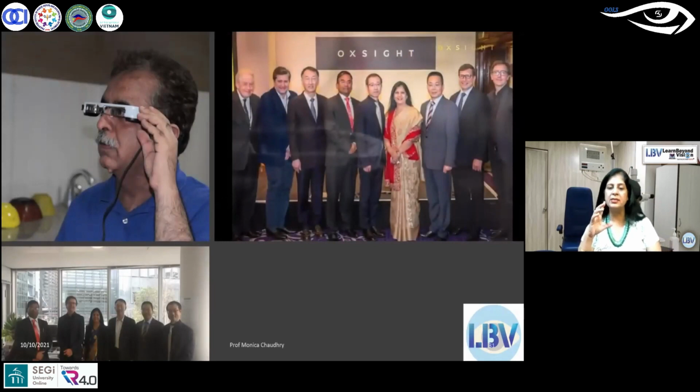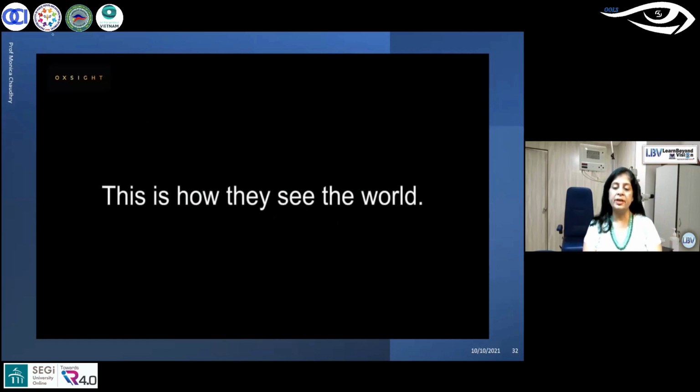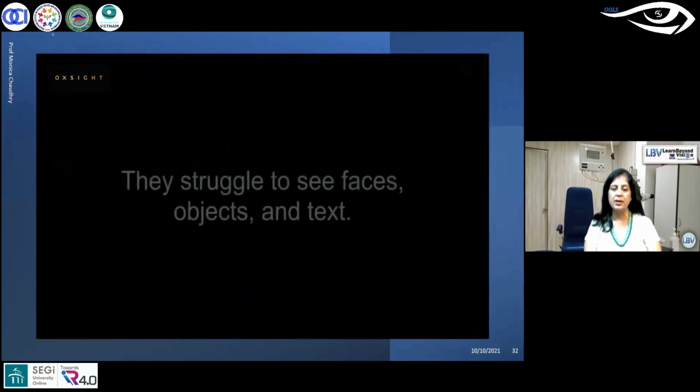As part of the trials we were doing, this was the prototype here. And I was part of the team where we did some trials on these augmented reality and virtual reality glasses. I want to show you a video about the next one. That was for peripheral field loss patients, and this is for central field loss, which we have launched this year in the UK. And the results are amazing. I would like to show you this video because it simulates how a central field loss patient can look.